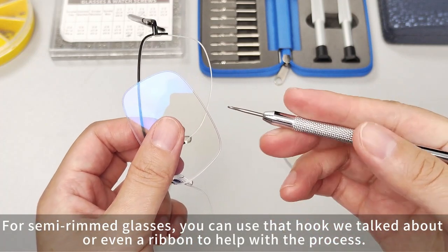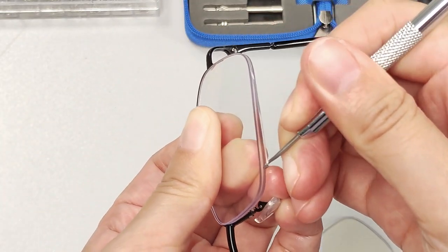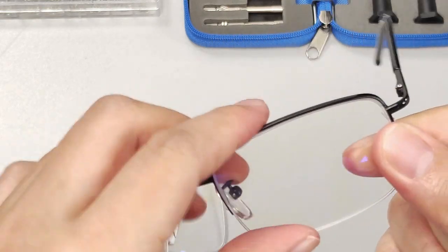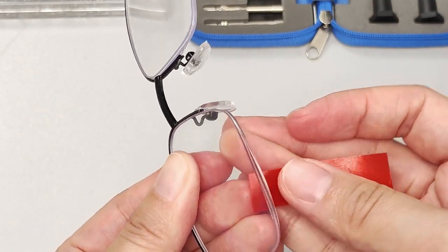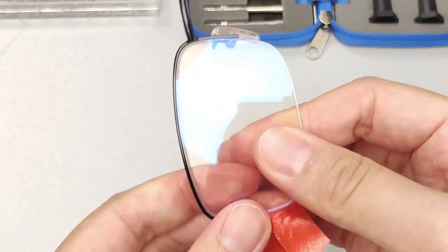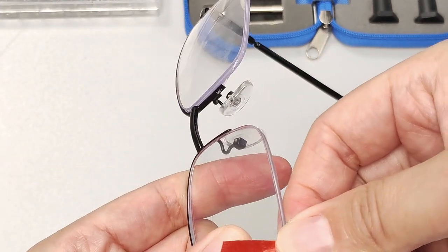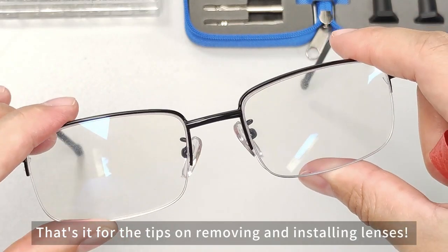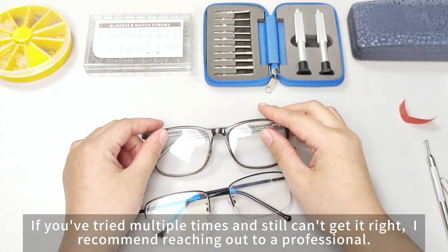For semi-rimmed glasses, you can use that hook or even a ribbon to help with the process. That's it for the tips on removing and installing lenses. If you've tried multiple times and still can't get it right, I recommend reaching out to a professional.